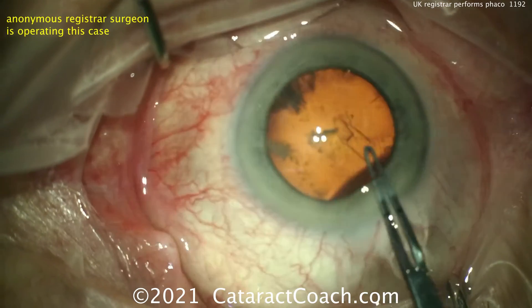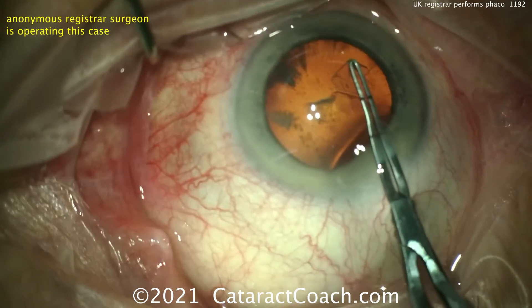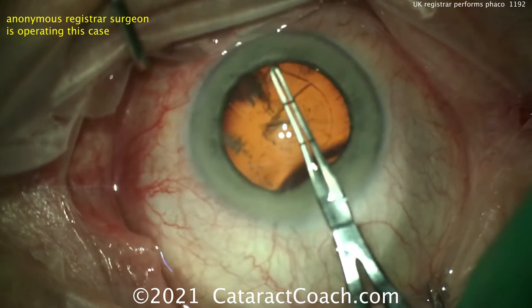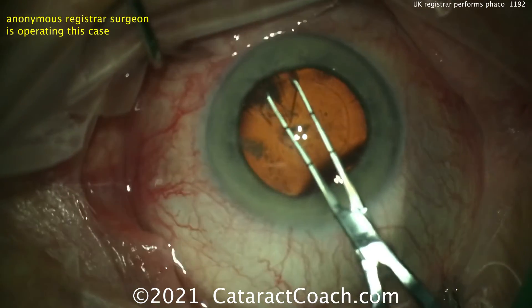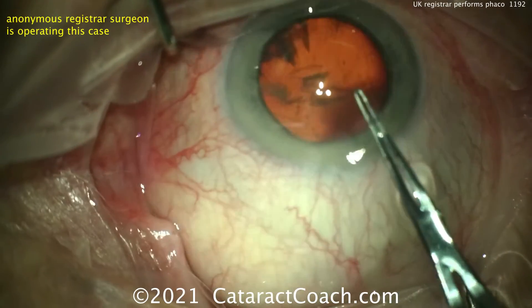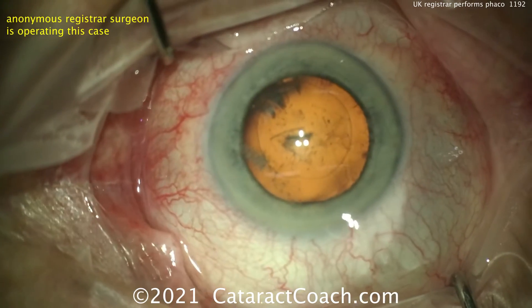This young surgeon is sitting superiorly — looks like probably a right eye. Rhexis looks good. Good pivoting in the incision. Grabbing the capsule and good pivoting, keeping that up, making a good, appropriately sized rhexis. It should be right on the nose, about 5 to 5.5 millimeters. That looks great. Getting that technique down — that's really good.